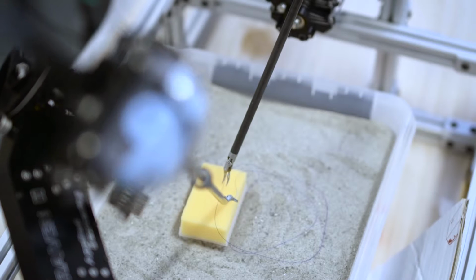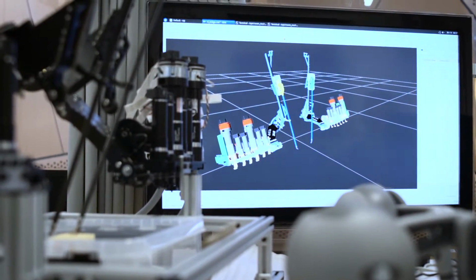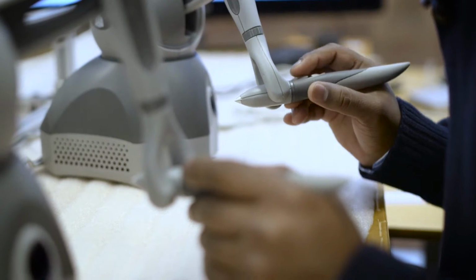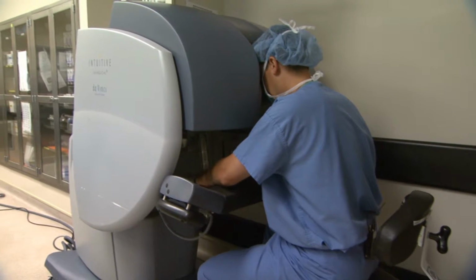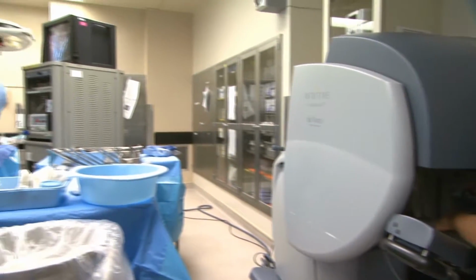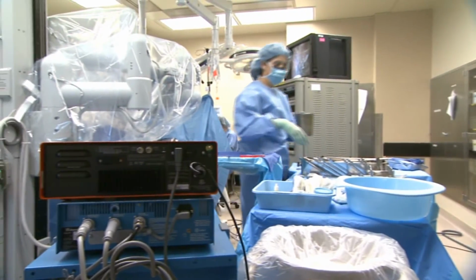Here in the Caro Lab, we want to develop a surgical action library. A surgical action library you can use to actually teach a surgical robot surgical actions. One of the advantages of an action library is that we can make complicated surgical actions available for less trained surgeons in the OR. For example, we can record a specific surgical action performed by a real expert in that action and then make it available for all surgeons in the surgery.